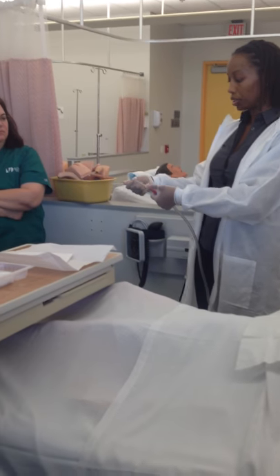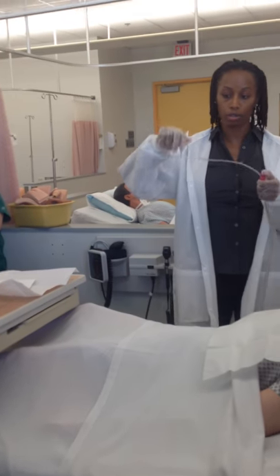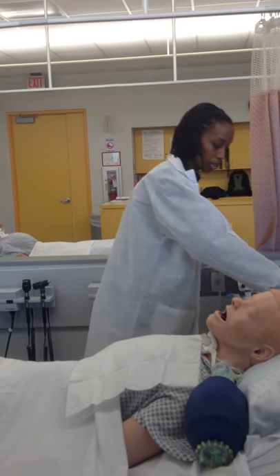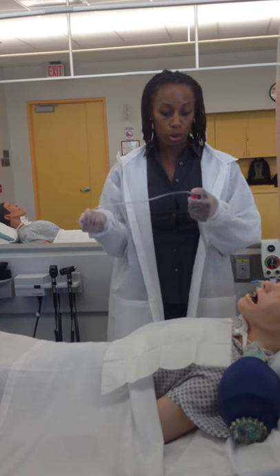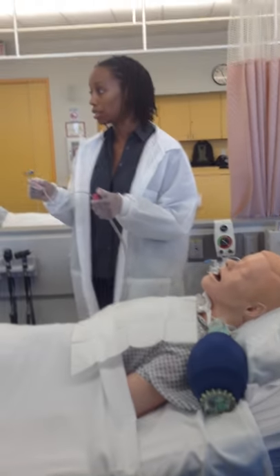To do the suctioning, you put your thumb over this. You're keeping this part sterile because if you contaminate this, you're pushing bacteria into their lungs. You can test your suction with the fluid, making sure that it goes in and completely clears the tube and everything's fine. At this point you would tell your helper: go ahead and pre-oxygenate, giving two breaths. You're completely set up and ready to go.